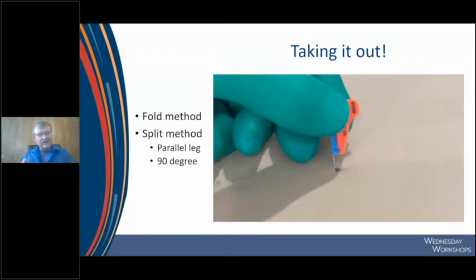So that is a positive for me. Over the years I've used this device, it is really significant in preventing that micropistoning and bacteria tract.